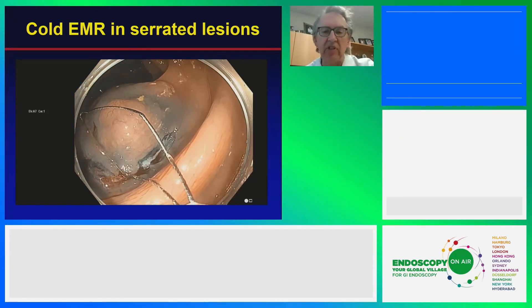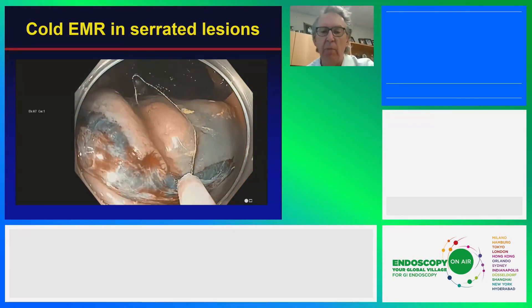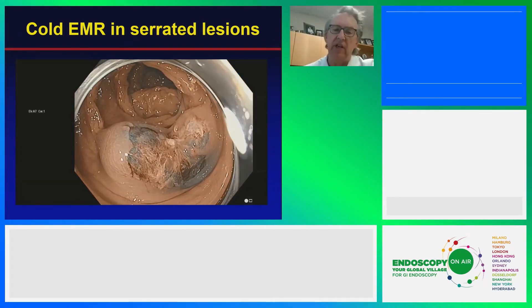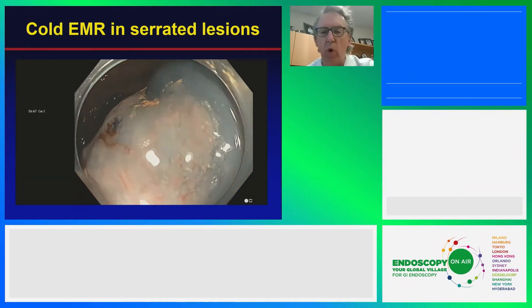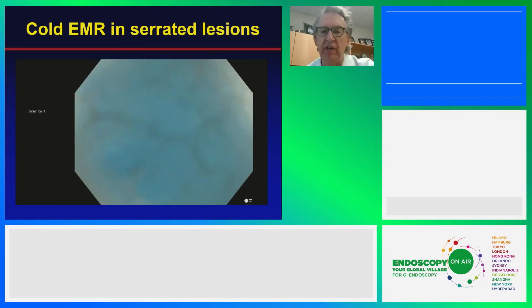Similarly, you don't have to clip these closed. Rarely, if you get an arterial bleed, you may want to clip that site, but otherwise you can leave it open. These are being done without epinephrine, but including epinephrine is a very nice thing. I use a concentration of one to two hundred thousand, but anywhere diluted even to four or five hundred thousand will produce a nice blanching effect.